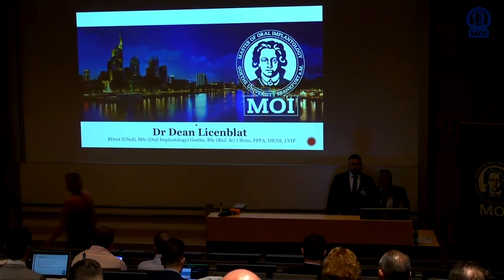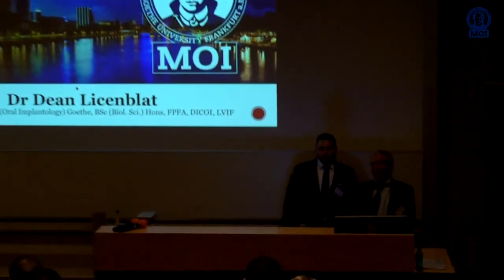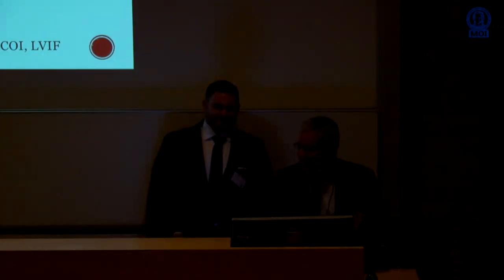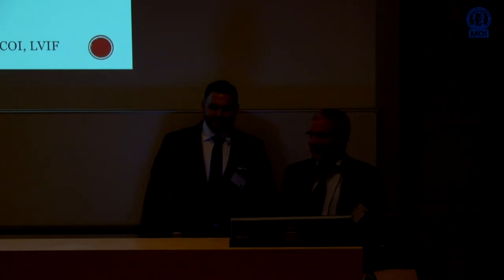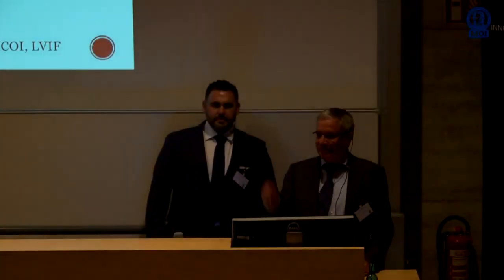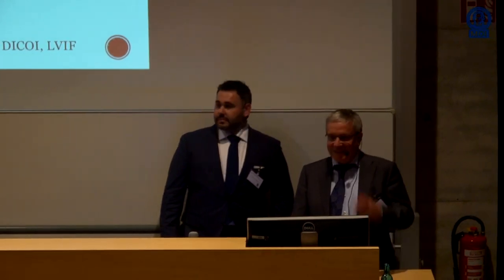And it's an honor for me, and I appreciate that a very nice alumni student from Australia is here and said, yes, I follow my invitation to have a lecture on a very interesting topic. You know, I'm a bit of a fan of the split-mouth design, because in my opinion, not the statisticians', they want to have mostly two groups with a lot of patients. But I think if you have more or less the same shape of an implant, but one made of titanium, which we have used for 50 years or more, and then zirconia, in the same patient, we can compare it really nicely.